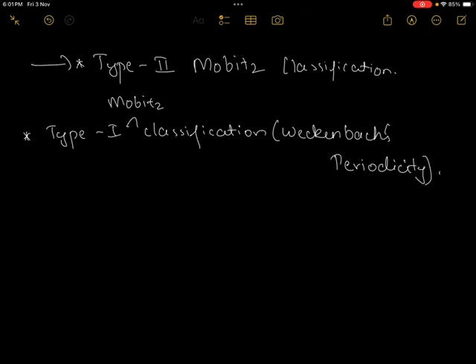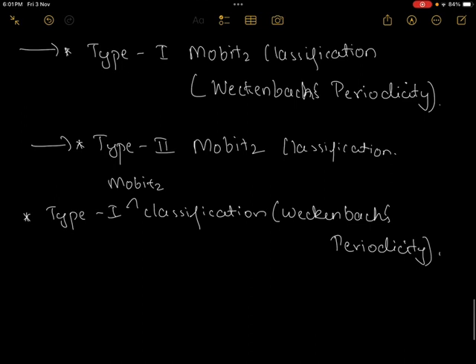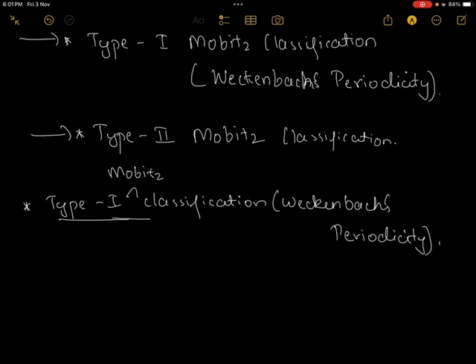As I have said previously, second degree heart blockage is differentiated from first degree heart blockage in terms of ECG aspect. There is a continuous formation of PQRST complex, and there is a sudden drop of QRST complex after some time, and there is only formation of P wave, and after an interval of time there is again formation of PQRST complex. So how do we classify the type 1 Mobitz classification in the second degree heart blockage?